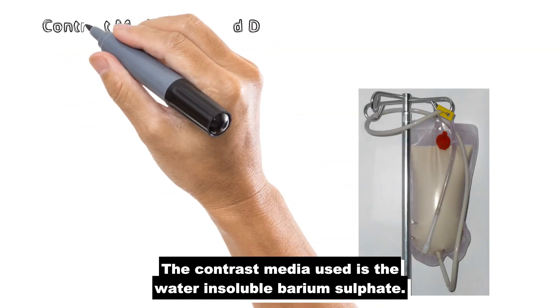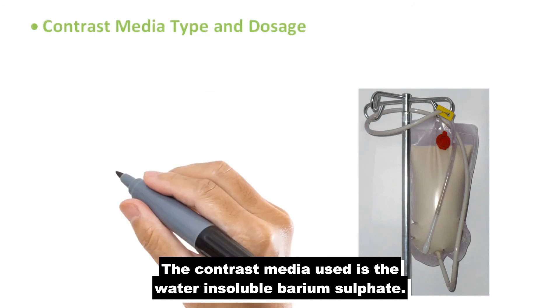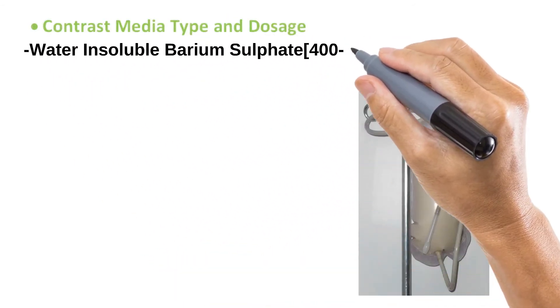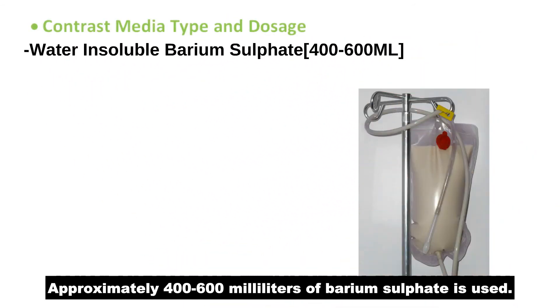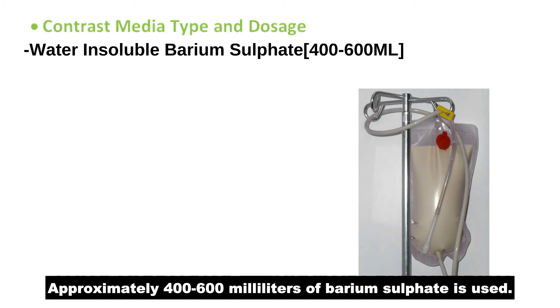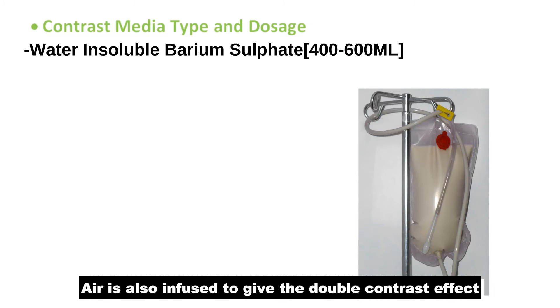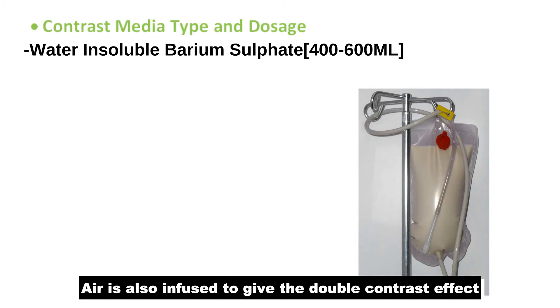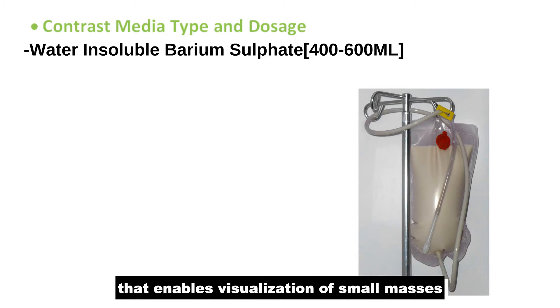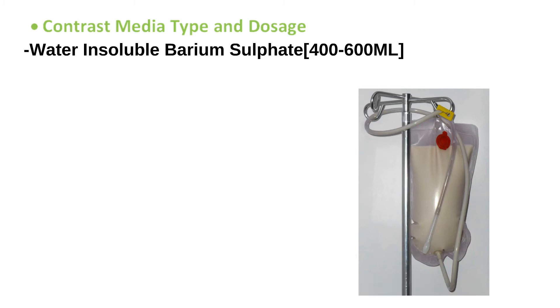The contrast media used is the water-insoluble barium sulfate. Approximately 400 to 600 milliliters of barium sulfate is used. Air is also infused to give the double contrast effect, which enables visualization of small masses.